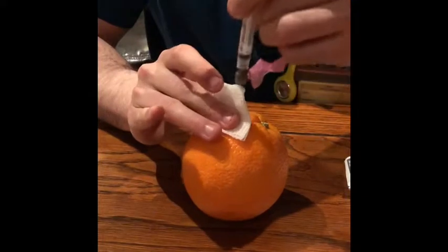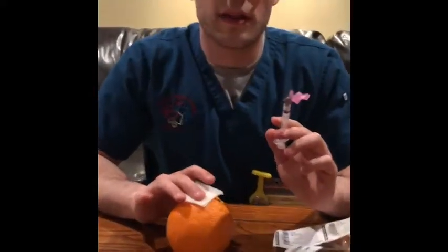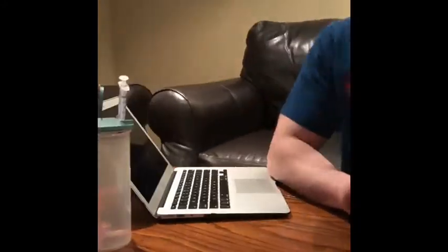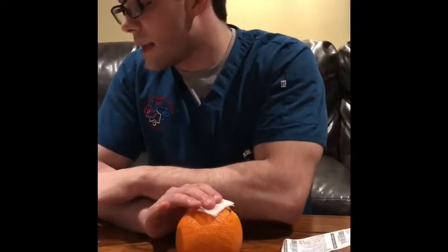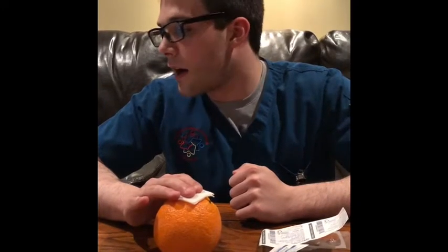And I'll be coming in with gauze and drawing up, and then holding the gauze there for the allotted time while disposing of the needle in the sharps bin. And then once that is done, I will verbalize my documentation. So I have administered 5,000 units of heparin subcutaneously, and then 1 milligram of Haldol intramuscularly.